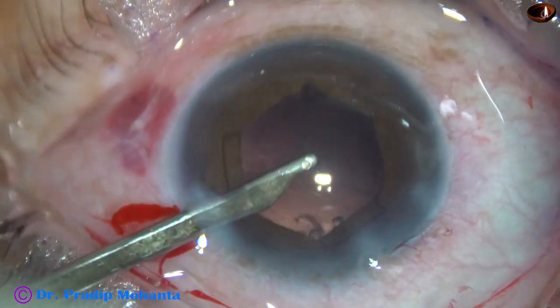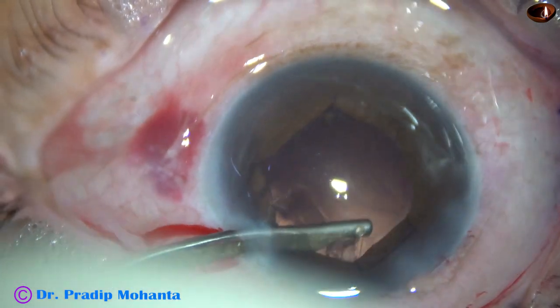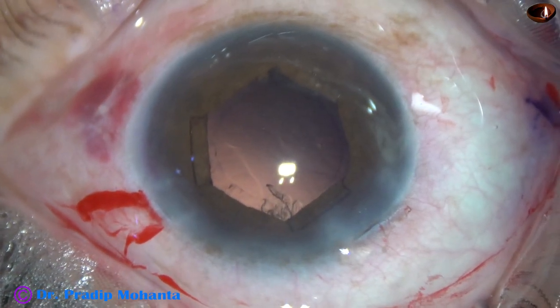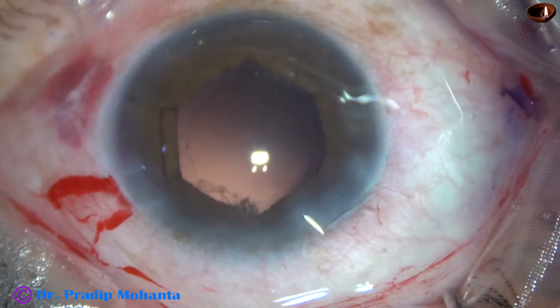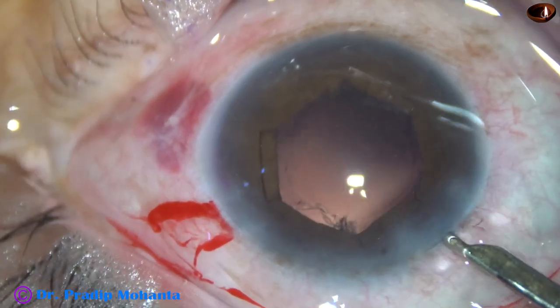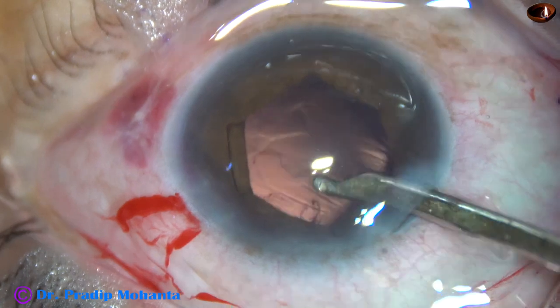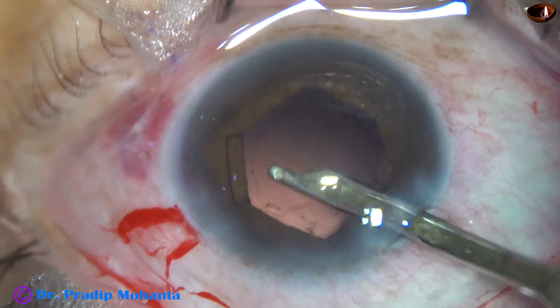But this small speck of cortex at 12 o'clock is not coming. When the anterior chamber is shallow we cannot go through the main wound — we will touch the corneal endothelium. So inject visco again to make the anterior chamber deep, and then go through the main wound. The visco will come out gradually and you will get about 10–15 seconds to remove that cortex. It has come out.